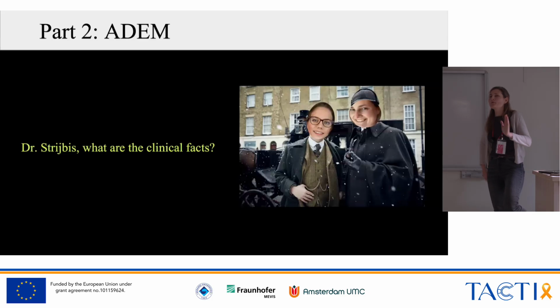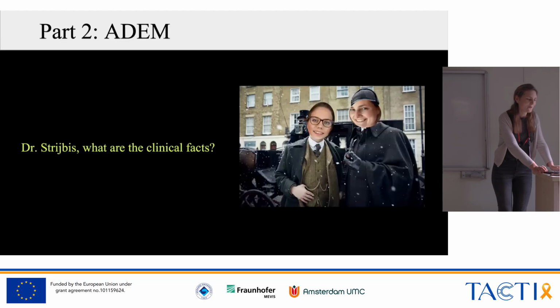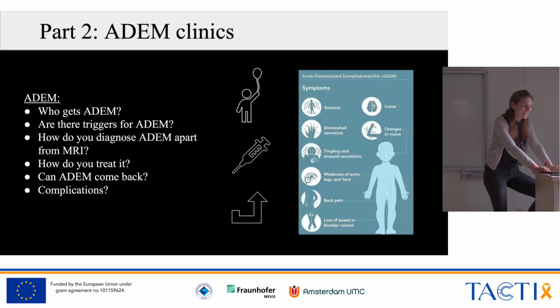Okay, well, luckily I brought some cases, brought, not bought. I would never buy for a case, no. Anyhow, so what is ADEM?